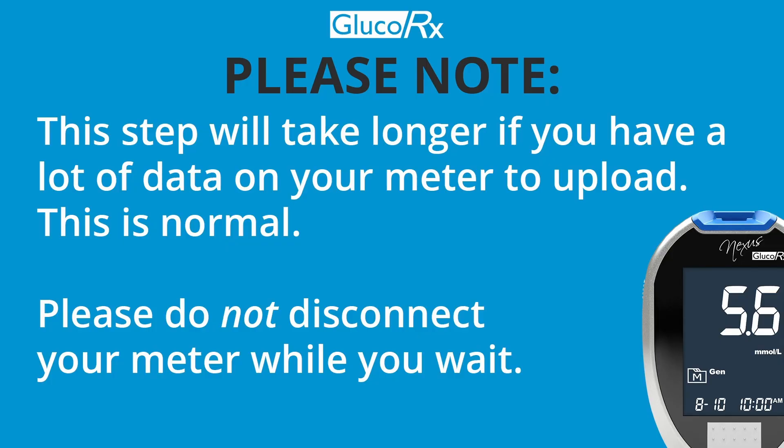Please note, this step will take longer if you have a lot of data to upload and this is normal. You will receive a notification on the screen when the readings have uploaded successfully.